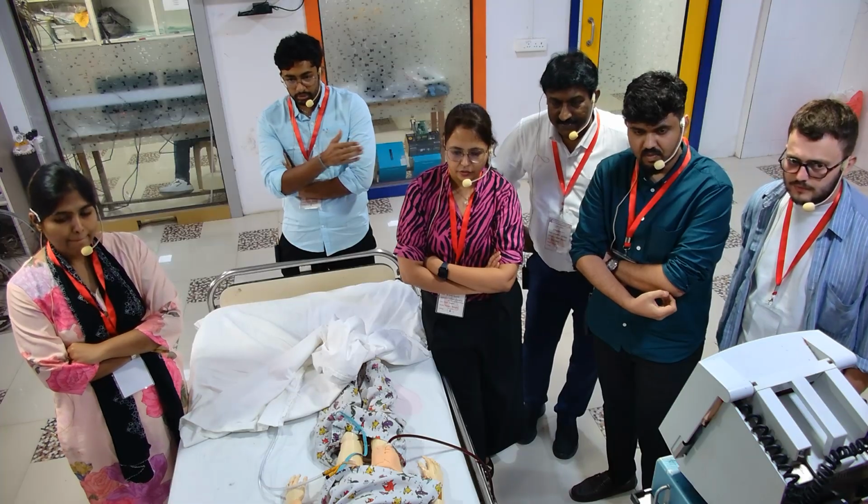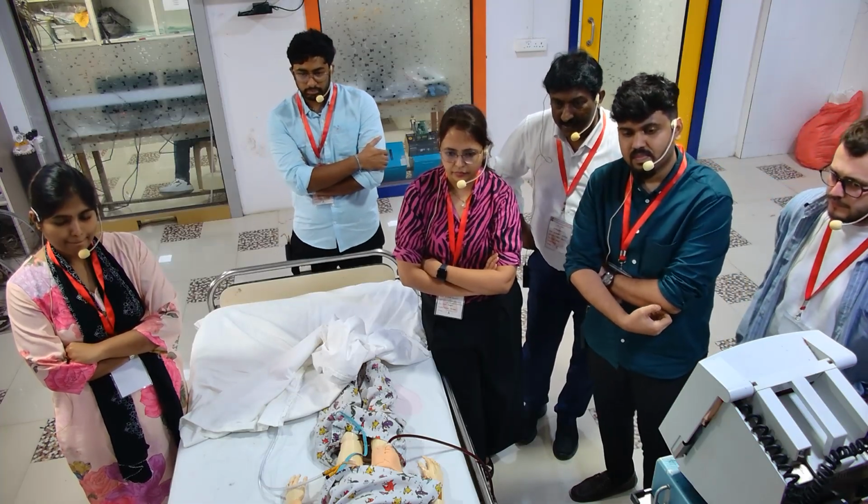Then we ruled out bleeding at the cannula sites. Now, if you go a bit ahead, was there chattering? No, sir. Usually, if there is hypovolemia, there will be chattering, because there is a lot of suction that the machine is going to do. Why didn't you see the chattering here? There was something wrong with the venous part. Because of the occlusion, yes, occlusion.